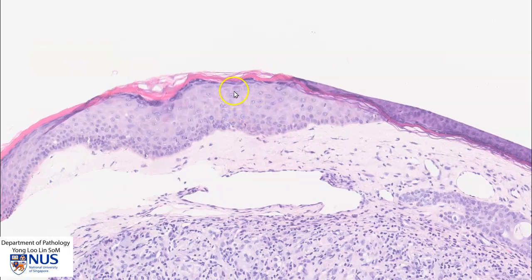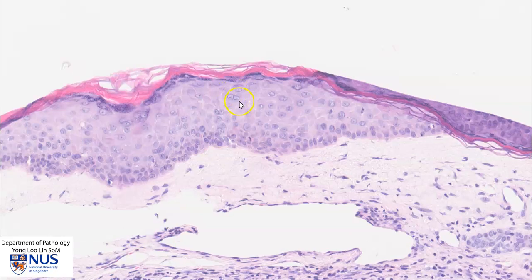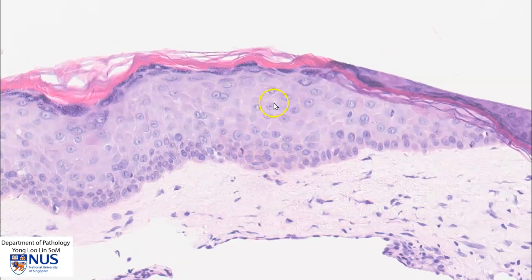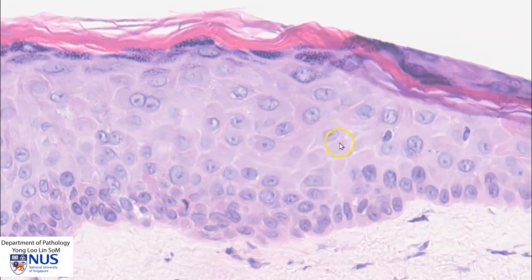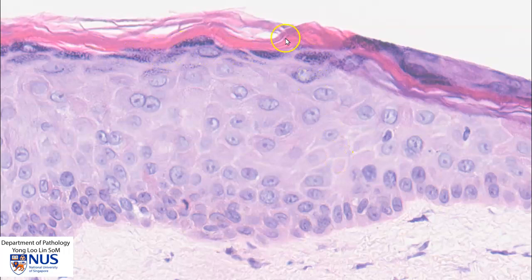Taking a closer look at the epidermis, this is composed of stratified squamous epithelium. We can see the basal layer, the stratified epithelium, and we can also see that there is a granular layer, and this is the keratinized layer, or the stratum corneum.